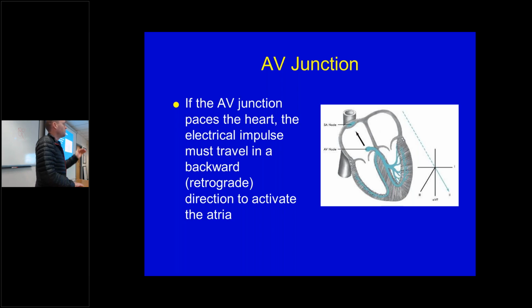It shows the positive or negative impulses in a certain direction, which gives you a positive or negative deflection. That's going to be important.